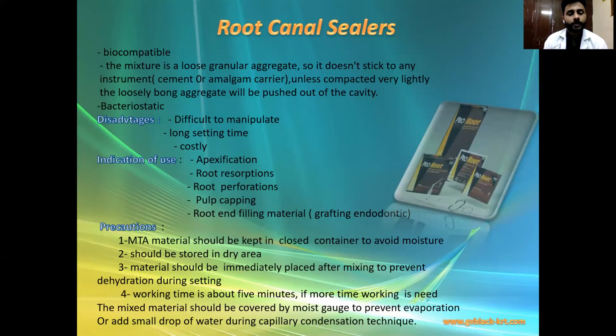Okay, the precautions to be taken while using MTA are the MTA material should be kept in closed container to avoid moisture. They should be stored in dry area. Material should be immediately placed after mixing to prevent dehydration during setting. Working time is about 5 minutes. If more working time is needed, the mixed material should be covered by moist gauze to prevent evaporation or add small drop of water during condensation technique.